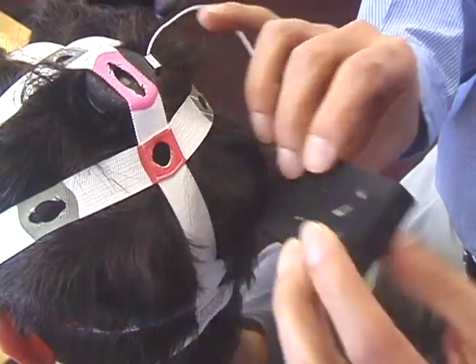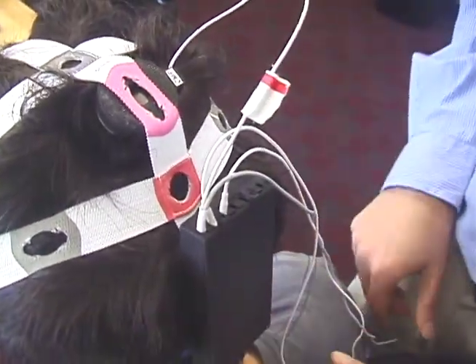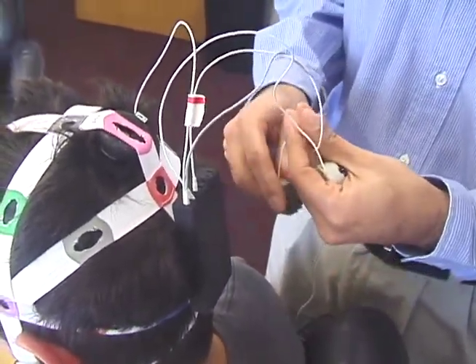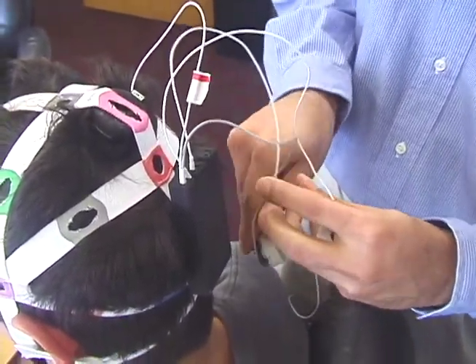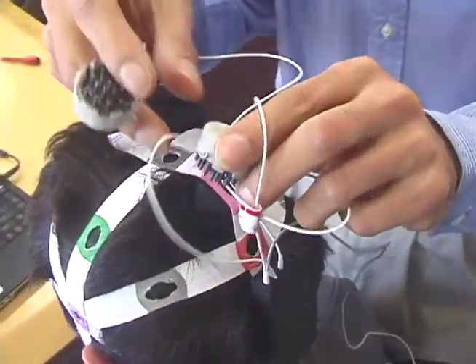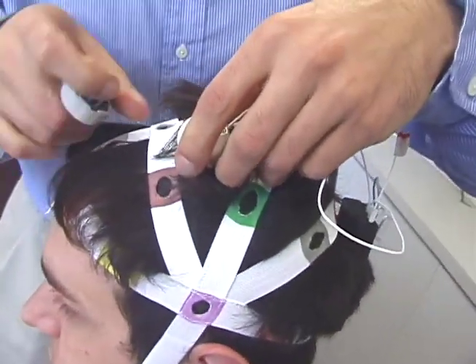You can attach the DSi-mini electronics box on the brain net using its Velcro or slide it under the brain net. Position remaining sensors at any desired locations using the same approach, being careful not to dislodge other sensors.